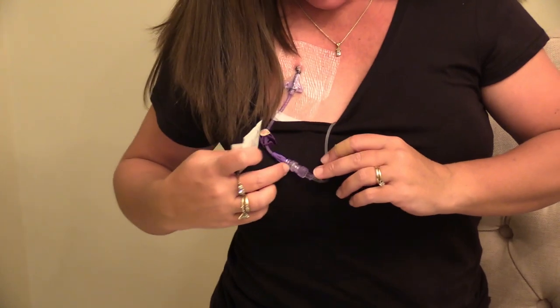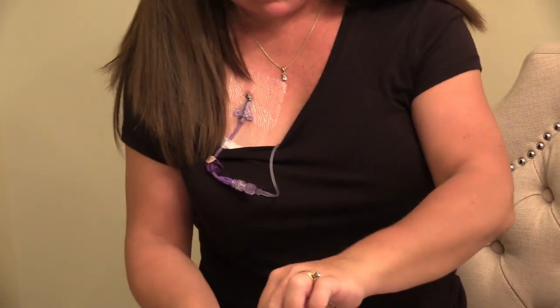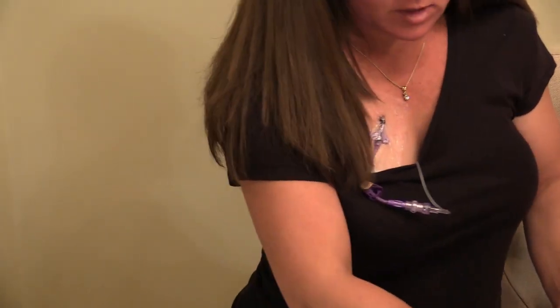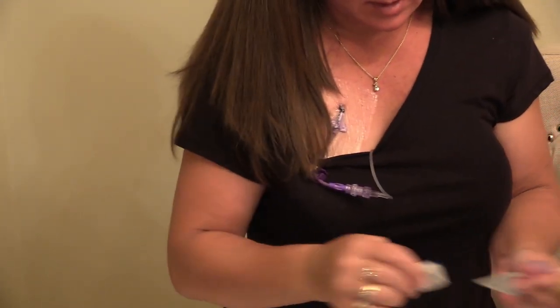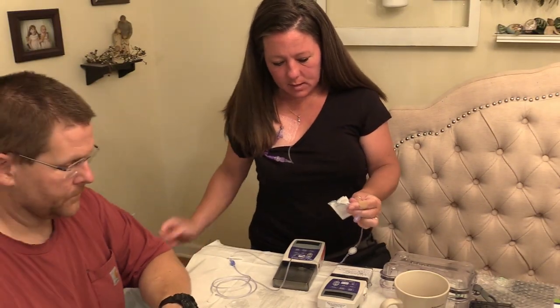Wipe it off — get that medicine off with the alcohol — because you don't want it on your hands. You have to be pretty quick with this part because you don't want to go too long without the medicine going through.